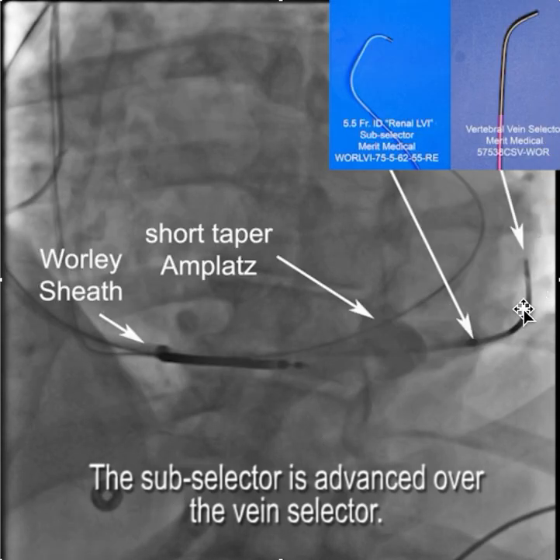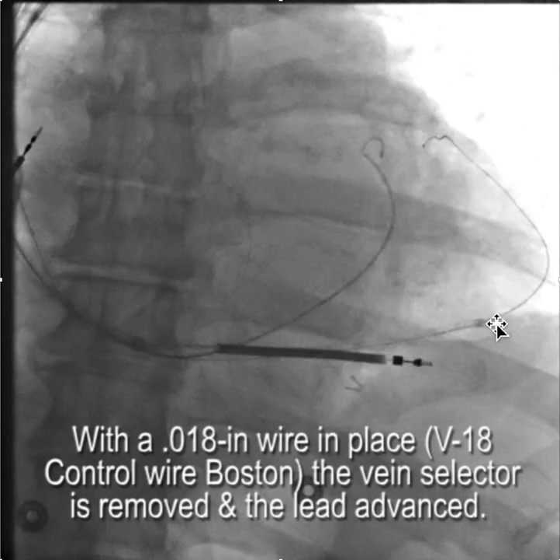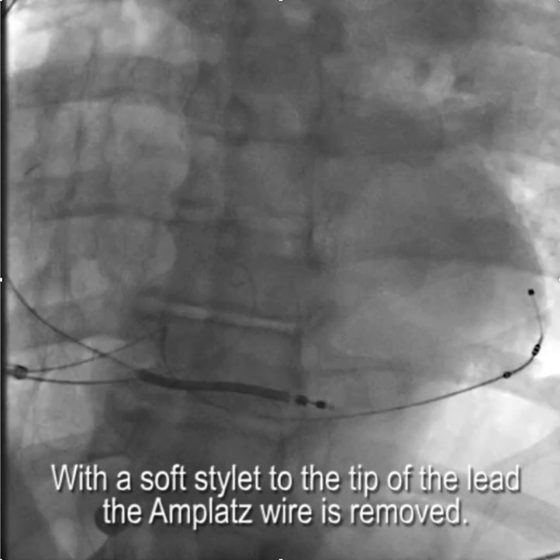Even without a wire, we were able to advance the vein selector deeper into the target vein. Once we had the vertebral vein selector deep in the target vein and the short taper amplatz wire supporting the sheath, we were able to advance the renal LVI subselector deep into the target branch. The next step was to place a wire through the vein selector — we chose the V18 control wire from Boston, an 018 wire, because it's heavier and stiffer. Only the Medtronic lead will advance over this 018 wire, and by being 018 it makes any 014 wire seem like a wet noodle. With a stable wire and the subselector all the way in, advancing the lead deep into the target branch was quite simple.